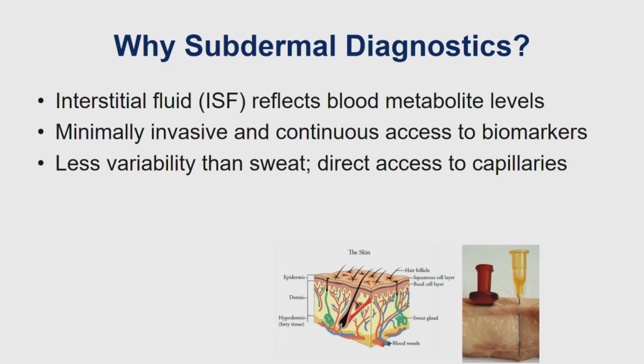Although the clinical evidence was that the more you use continuous glucose monitoring sensors, the more control you have on your glycated hemoglobin. Does everybody understand glycated hemoglobin here? For those of you who don't know, the main component of the blood is hemoglobin. The main function of hemoglobin is to carry oxygen.